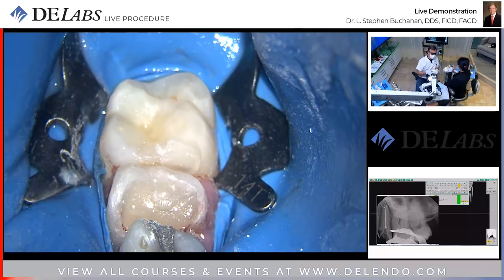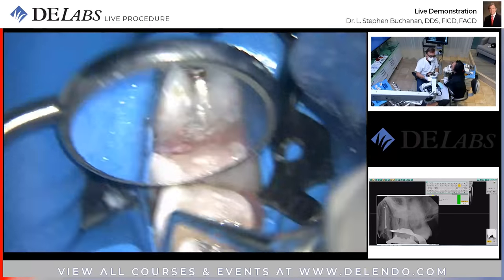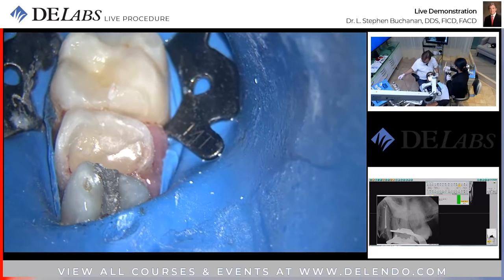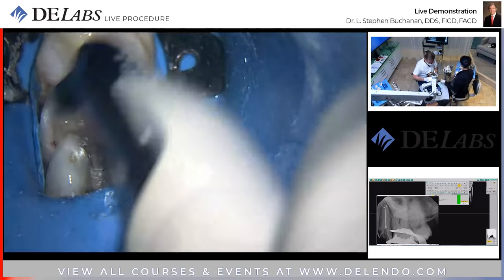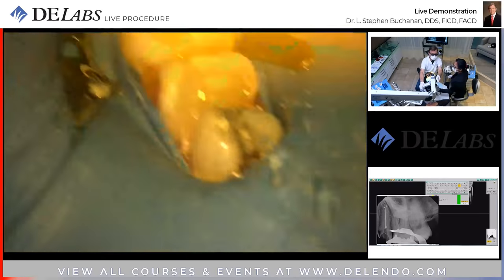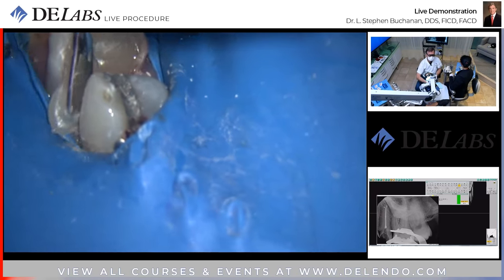Take the rubber dam off. Wait a sec, is that sealed down there? Maybe just a little bit more. Just a taste. Turn to the right, please. Thank you. There we go.